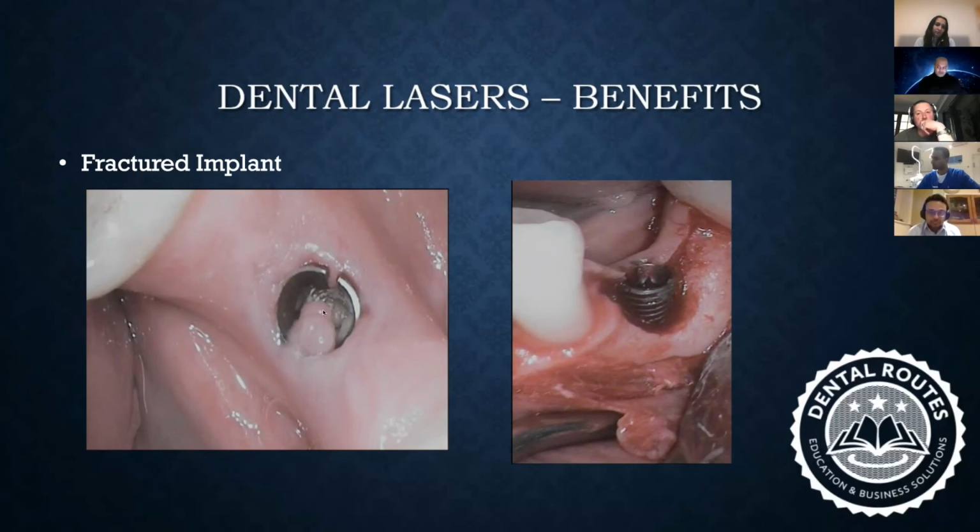was put in some other practice, and he was referred to me by one of my dental colleagues. And the same case, what I would have done probably before I was using dental laser. So I had to have initial surgery just to retrieve the dental implant, to disinfect the whole socket, probably maybe augment, or just leave the socket to heal on its own, get the patient back after 4 to 5 months, revisit the site, place an implant, 5 to 6 months later, restore.